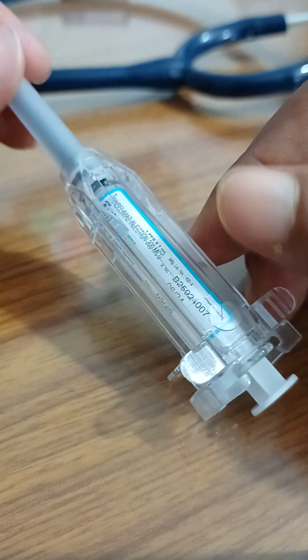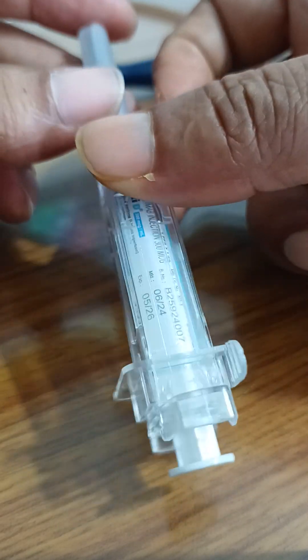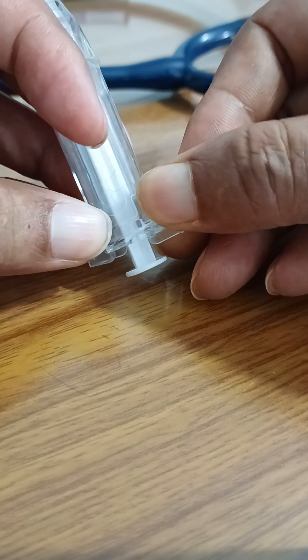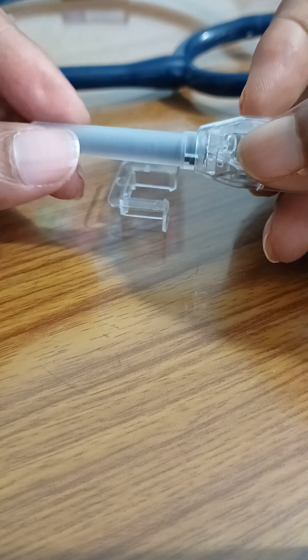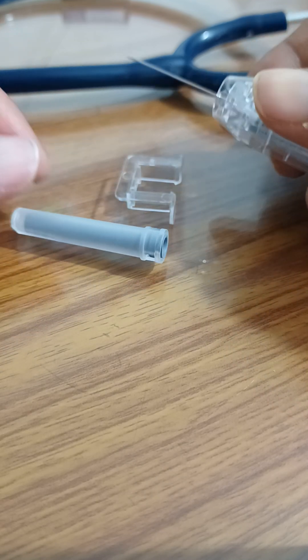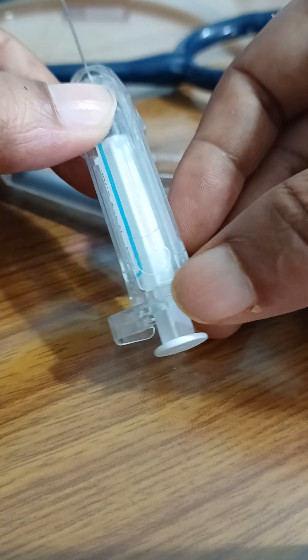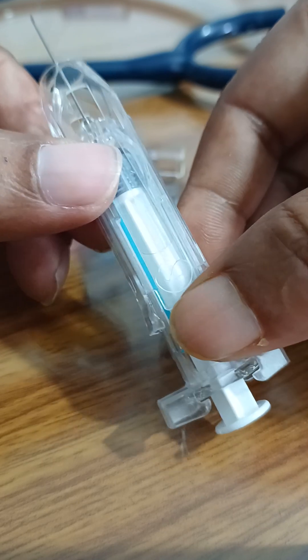This is a syringe for supplying NTD injection. We have to remove this lock first. Now remove the needle cap carefully. The size of the needle can be adjusted by pulling this forward.